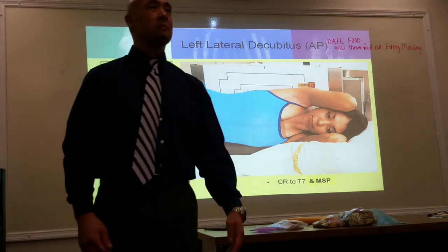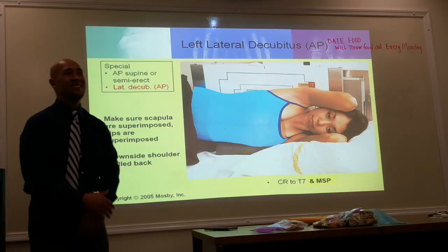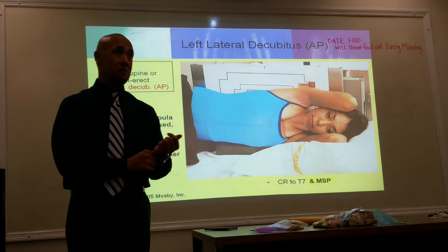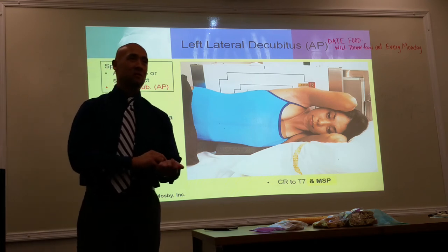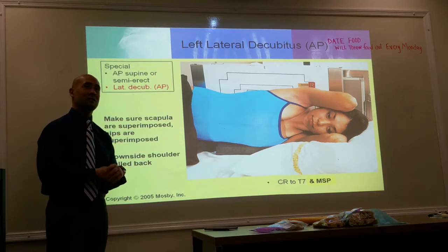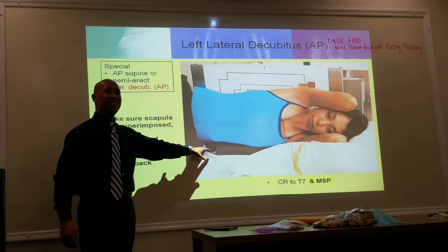Does that affect the penetration? Do you know how, like, the anode and cathode side? Yes and no. Yes, if we were doing film. With CR or DR, it corrects everything for you. Yeah, that's a good question.